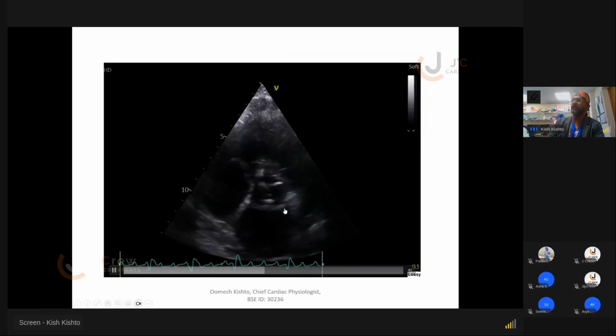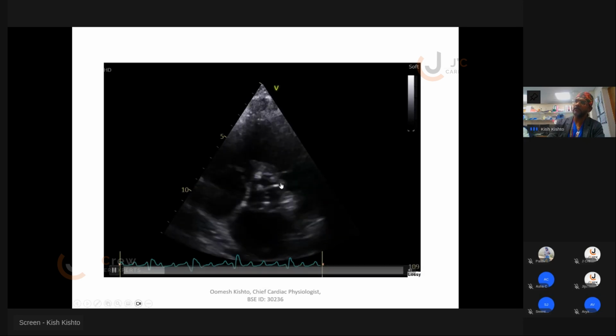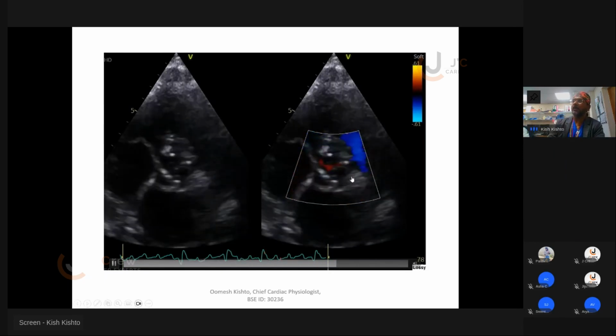And this is your tricuspid aortic valve, and clearly you can see there is focal calcification of the right coronary cusp and the non-coronary cusp, and then the left coronary cusp appears fixed there, doesn't seem to be moving much there. So again, when you describe your tricuspid aortic valve, just put all these things into it as well. So just trivial AR.